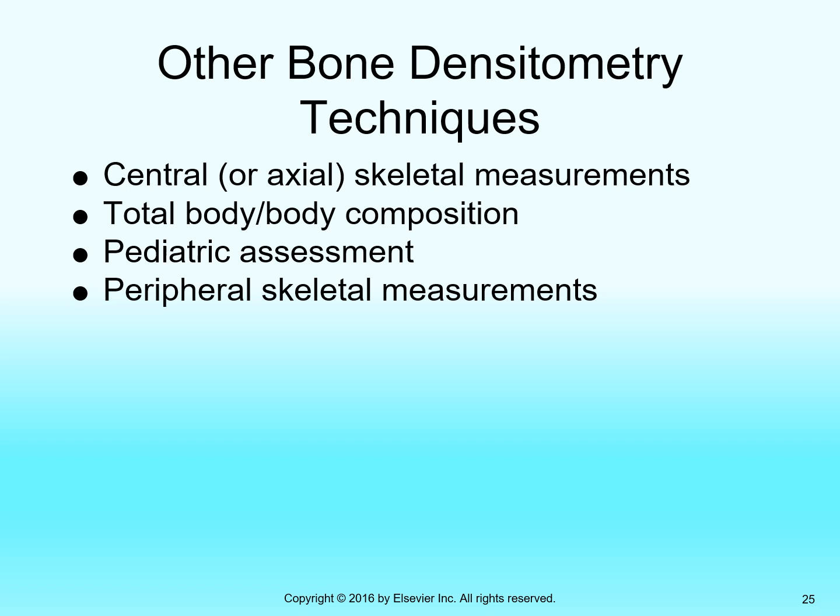So first of all, you should be a registered bone densitometrist before you're taking on things that are outside of the ordinary. And you should make sure that your machine is capable of doing those protocols because the calculations might vary.